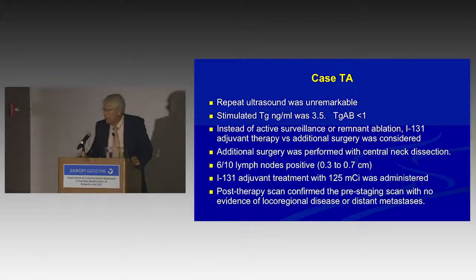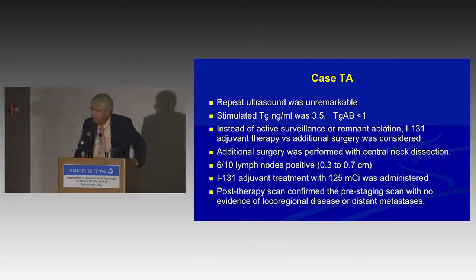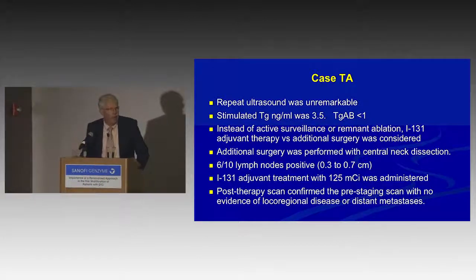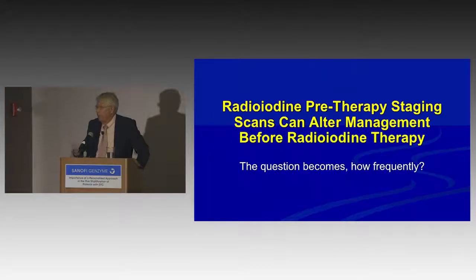And the post-therapy scan confirmed the pre-staging scan with no additional evidence of local disease or distant mets. So radioiodine pre-therapy staging scans can alter management before radioiodine therapy. Post-therapy scans are great. They're not perfect, by the way. Although they're considered to be sacrosanct, they are not perfect, but they're always post-therapy.